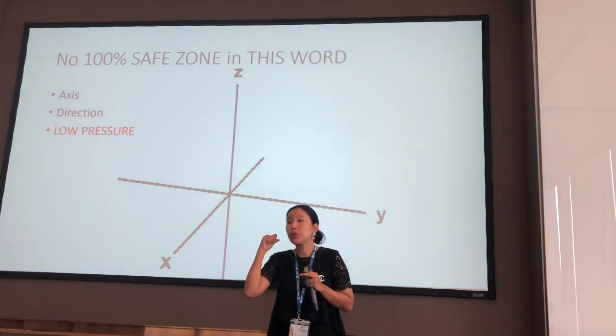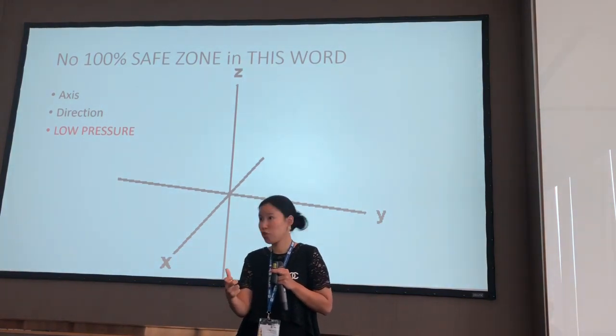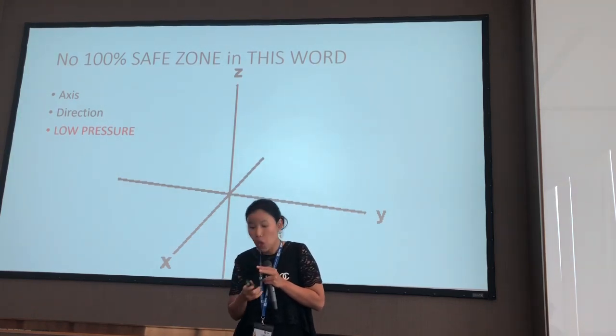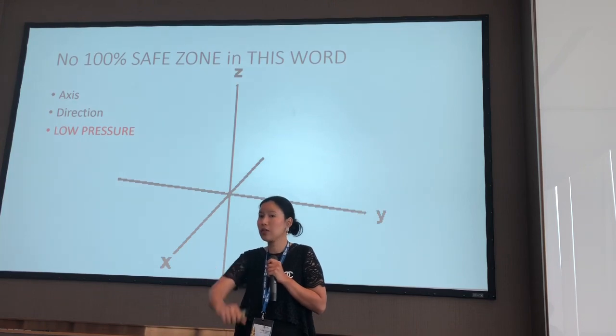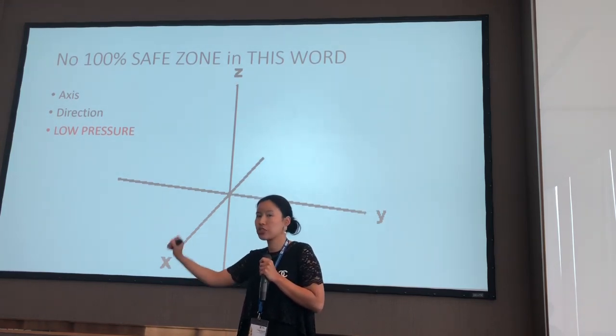So even if you hit the vessel, but your pressure is less than the pressure in the artery, it will not cause the complication. It's right, even if you hit it. So low pressure injection is the key. Okay, good anatomy knowledge, good skill, be careful, and low pressure injection.